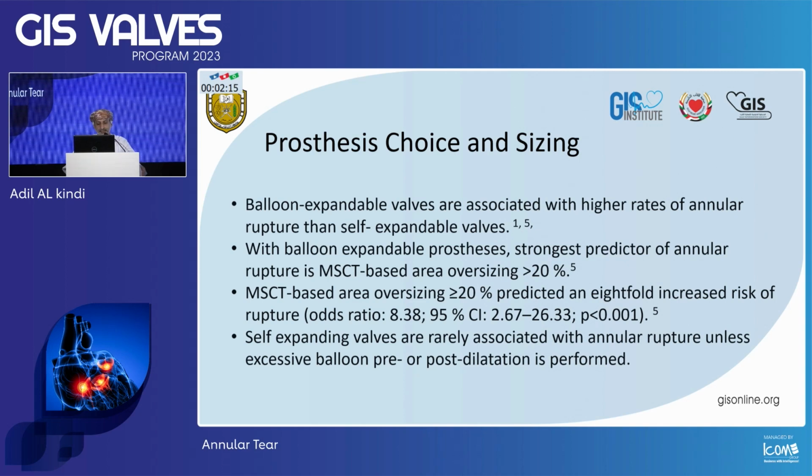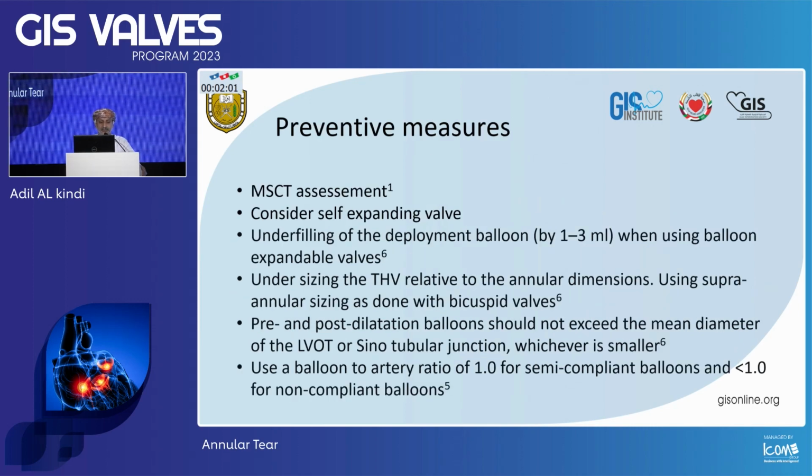And self-expanding valves rarely cause annular rupture, but there are times when we pre or post-balloon dilate, and this could increase the risk as compared to the balloon expandable.